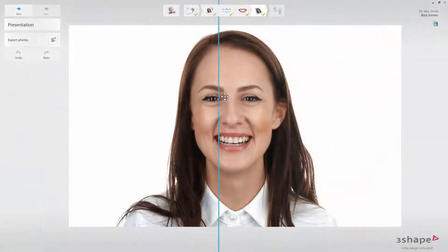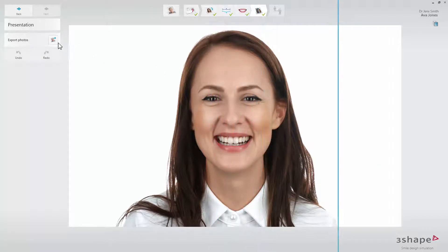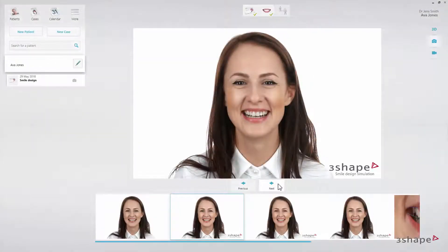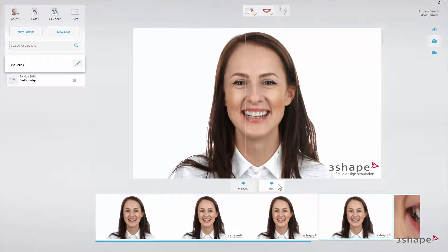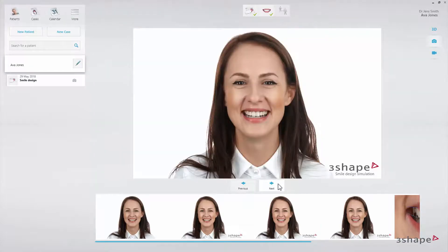When the design is ready, you can use the Export Photo option to export photos to a chosen location. When you close the case, the software will also save the smile design pictures to the case automatically. Both input pictures as well as ones created with Smile Design will be visible in the case overview.